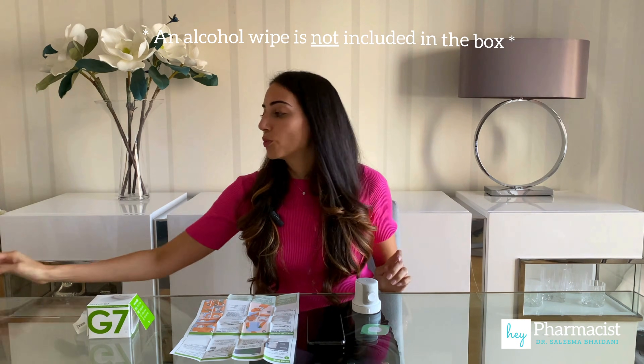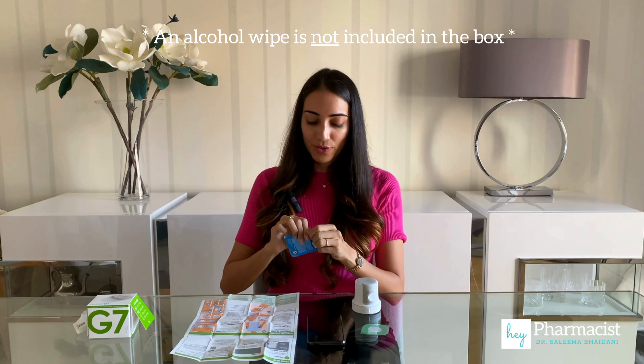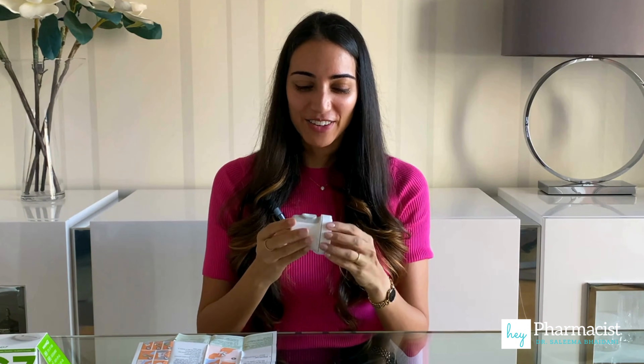Now that the sensor site has been chosen, it's time to prepare the area with an alcohol wipe. Now that that's dry, I'm going to go ahead and insert the Dexcom G7.